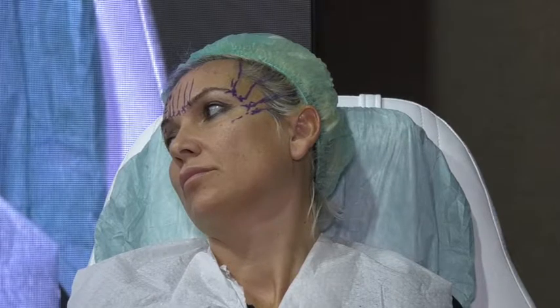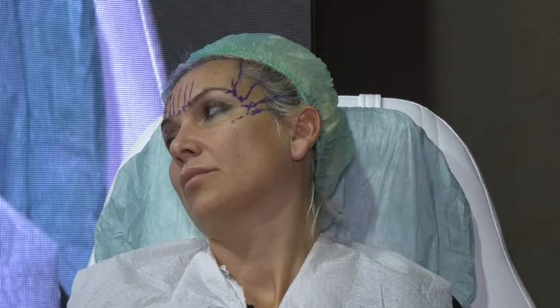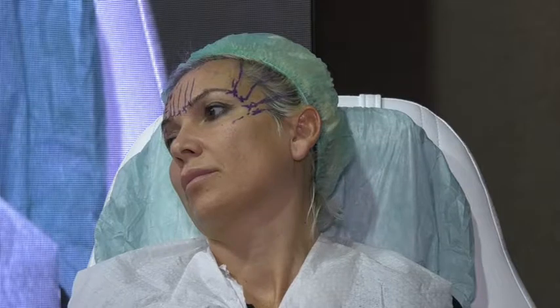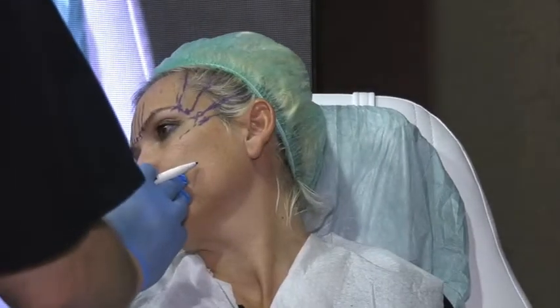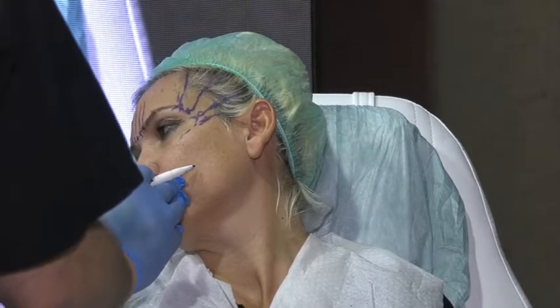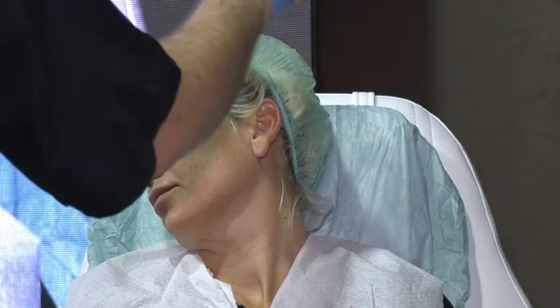I wanted to ask, regarding the cat eye, the area between the angle of the eye and the hairline is too short. Should I insert the thread a little bit longer after the hairline, or still one or two? No, come on. You cannot stay there. Look at my lines. You see my lines? Look. Did I stay at the hairline? Yeah, I mean, a centimeter is enough, or shall I? No, for this one, like 3-4 centimeters. Look where my lines are reaching. I reach it now. You see?